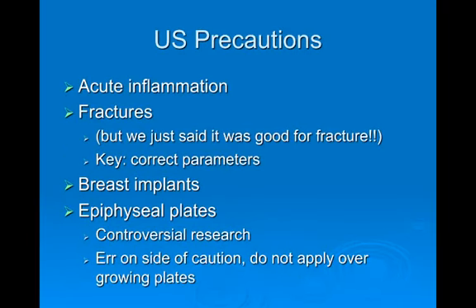Okay, so precautions. Acute inflammation. It's a precaution because you don't want to heat things up, but if you're using pulse mode, you're probably okay with that. Precaution over fractures. Okay, so maybe a little conflicting from what we just said. It's good for fracture, but the key is that you use the right parameters for it.